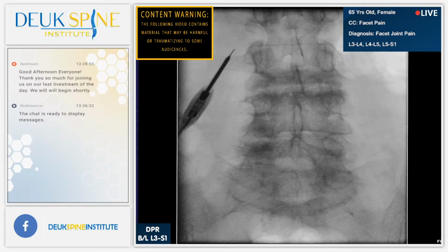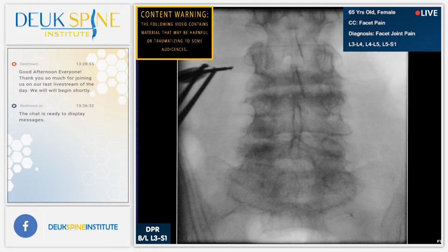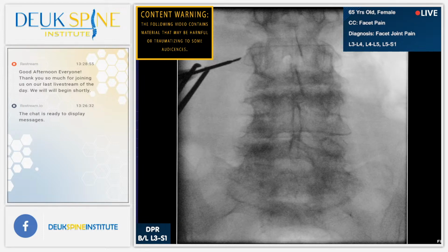And if I can get to where we need to be, that's closer. But you can't be close. You have to be exactly on the spot. And that's why you use an X-ray to navigate and get to exactly where you need to be. That's exactly where we need to be, right there. That is the perfect spot. And once I get there, it's amazing. I get on the bone and then her muscles tighten up and it literally pushes my bovie tip away. It's pretty interesting.